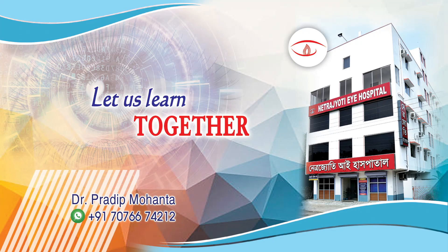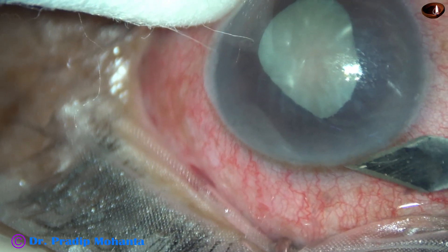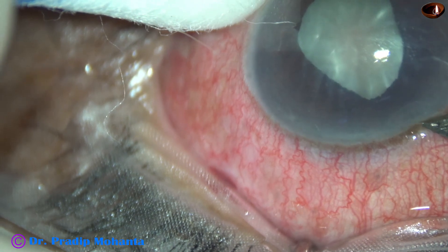Friends, welcome to my workplace at Ranakhat, West Bengal, India. This is a case of phacomorphic glaucoma. Let us observe this surgery.